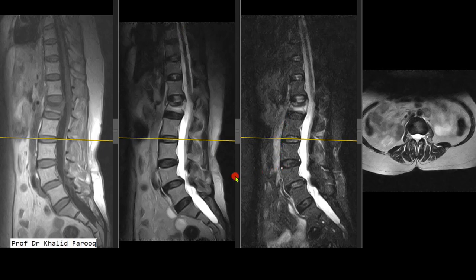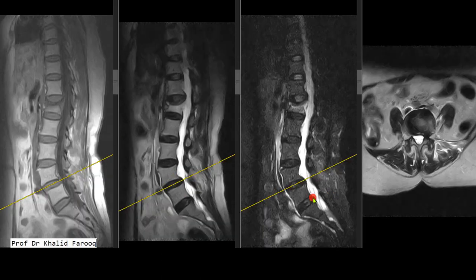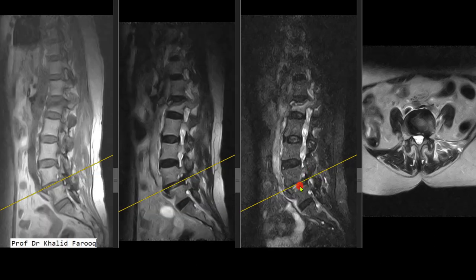There is mild anterior displacement of L4 over L5, suggesting grade 1 spondylolisthesis. There is left-sided disc protrusion causing moderate to severe narrowing of the left exiting neural foramen at this level.